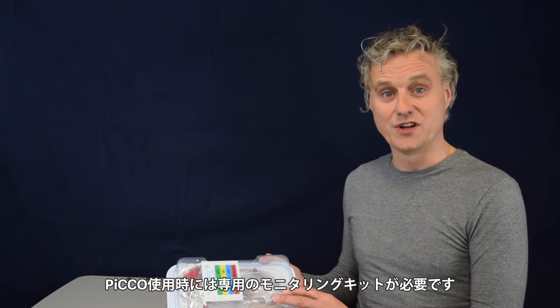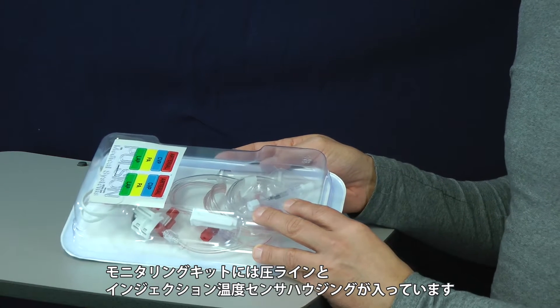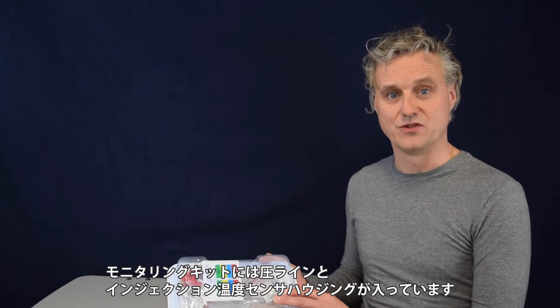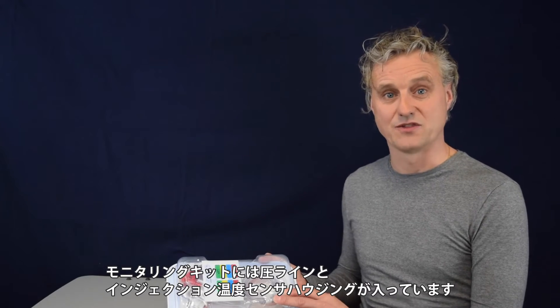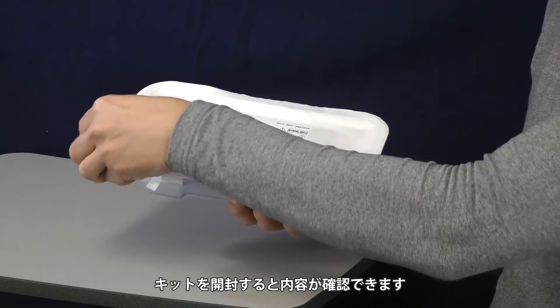Besides the Pico catheter you also need a monitoring kit. This monitoring kit provides you with an arterial pressure transducer and a central venous pressure transducer. Included in this kit there is an injectate sensor housing. When opening the box you will find the right items inside.